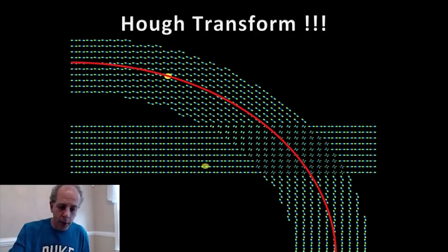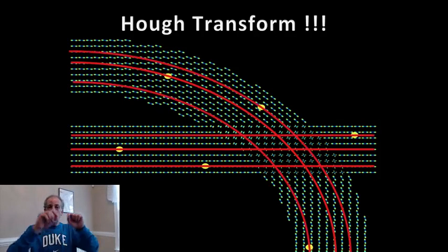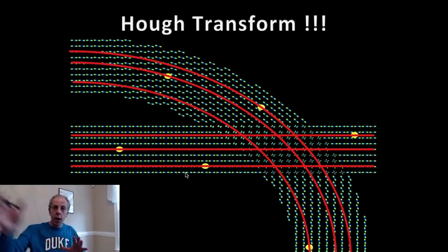Then you pick another point and you do the same. You pick another point and you do the same. And in that way, you get these tracks. You get from every point, basically, this probability of having these cables and connections.